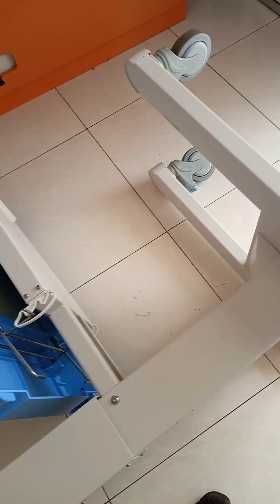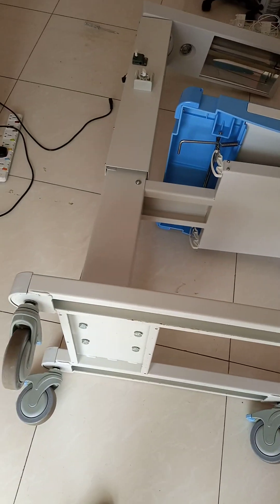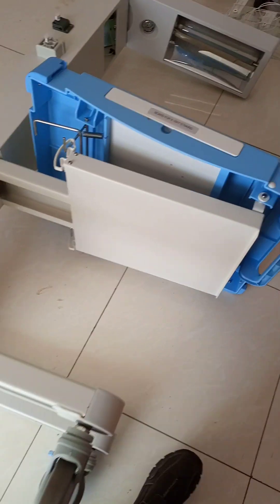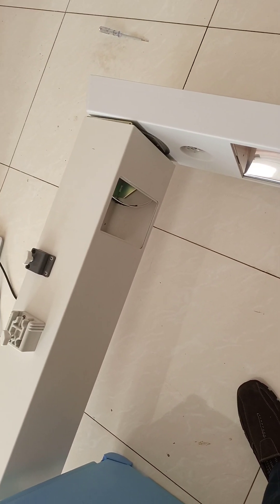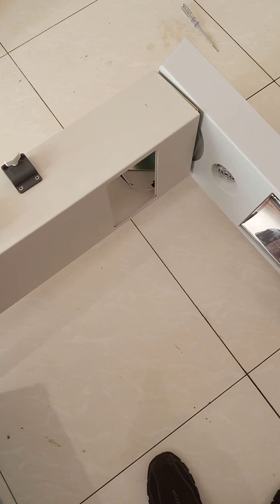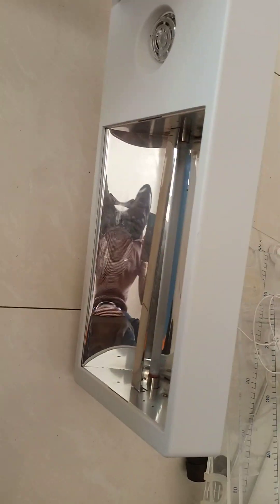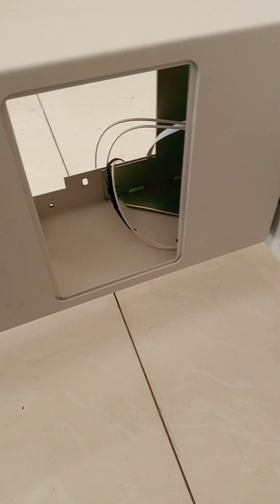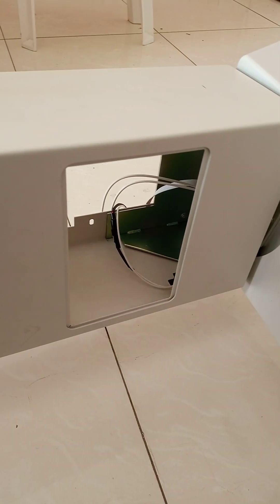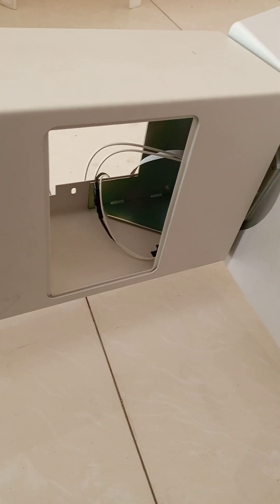This is an infant radiant warmer, model IR-200. This machine was reported not to be heating up. My first thought was that the heating element was faulty. The machine was powering on but not generating any heat. I replaced the heaters, but the problem was not solved.